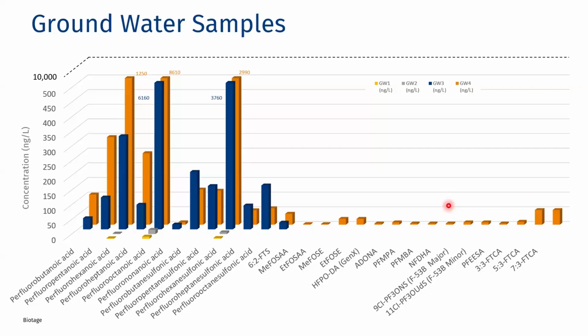Of course, we did cleaning just to make sure the system can be cleaned after processing these high concentration samples. I zoomed in, so my chart cuts off at 500 nanograms per liter, so you can see the detail of these samples. However, the ones that have their numbers on them actually expand beyond it.